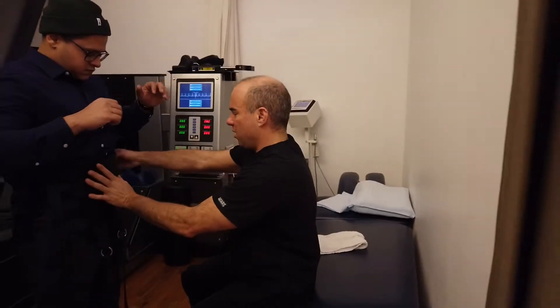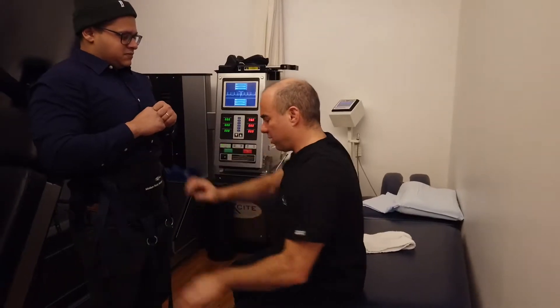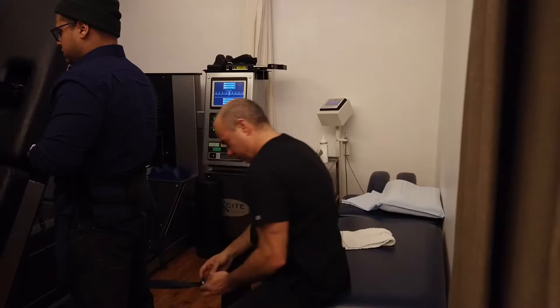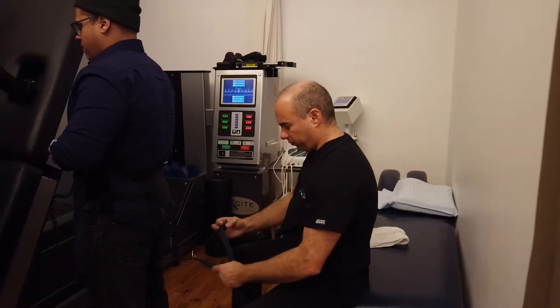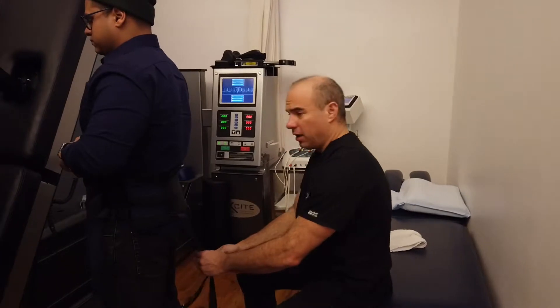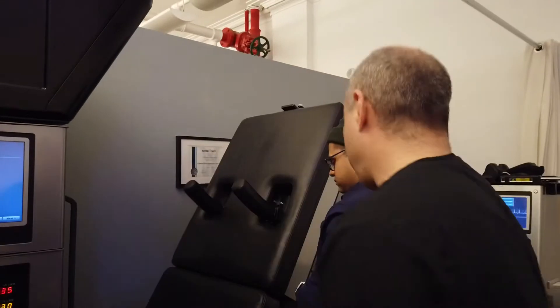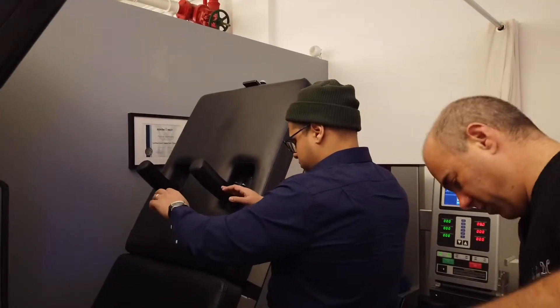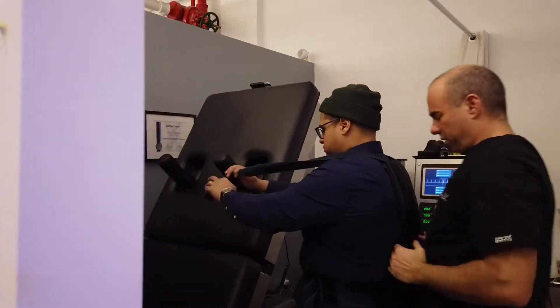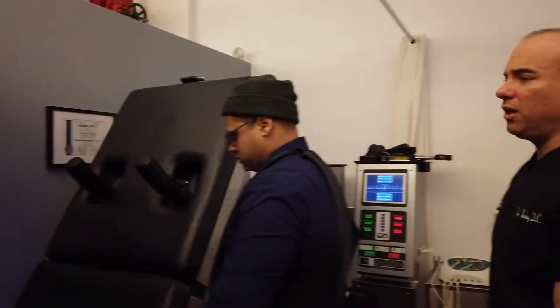Let's be really precise — we'll have to readjust it more than once. We'll get the harness on. Pull up on it a little bit. Hop up on the machine.